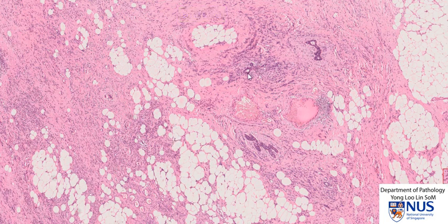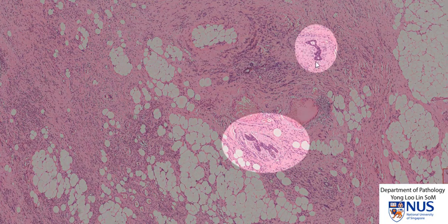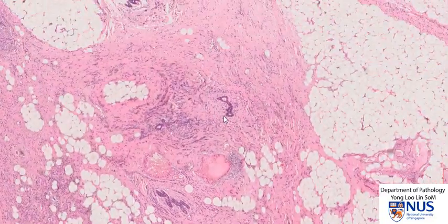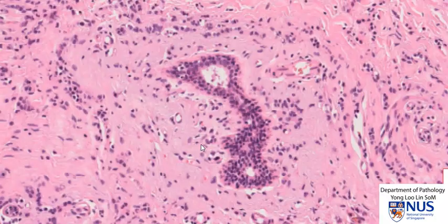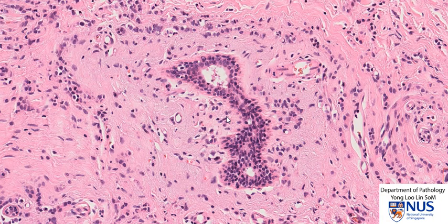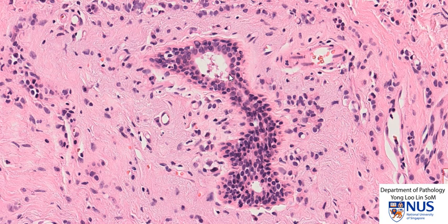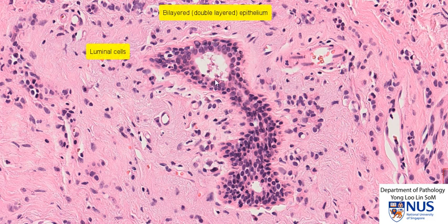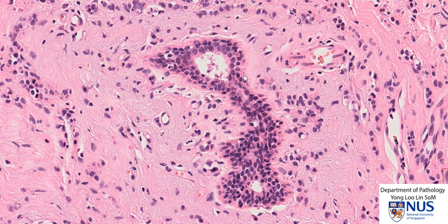At the same time, we can also appreciate some ductal and lobular structures at this magnification, and I'm going to zoom in onto one of the benign ductal structures where we can see quite clearly that the epithelium is bilayered, so there are two layers of cells — the luminal layer here and the outer basal layer. The presence of two layers of cells lining ducts and lobular structures is good evidence that we're looking at benign breast parenchymal elements.